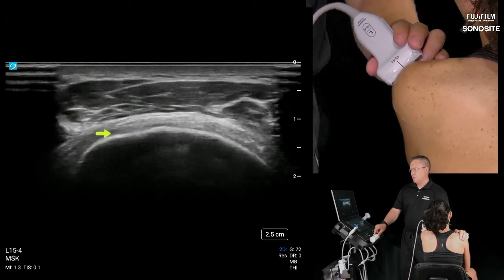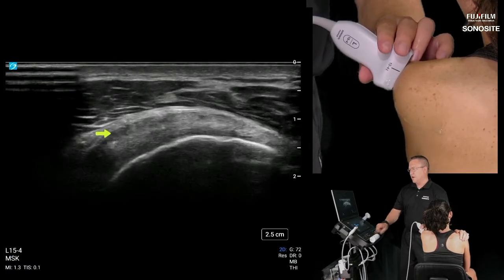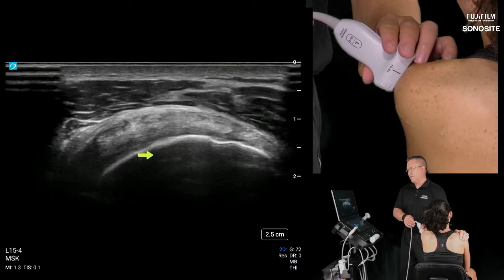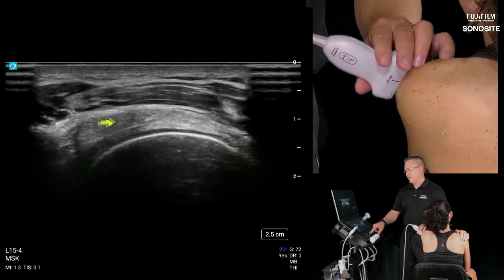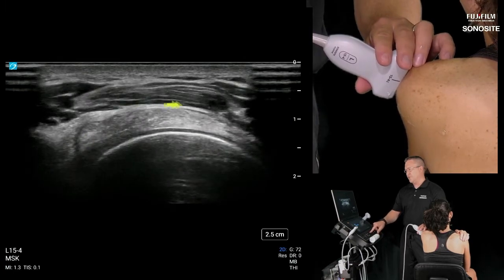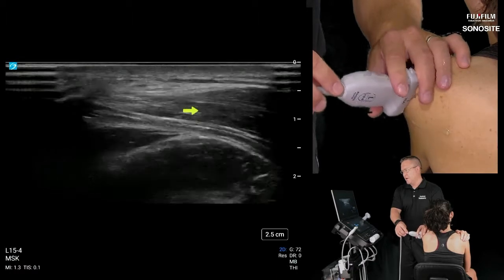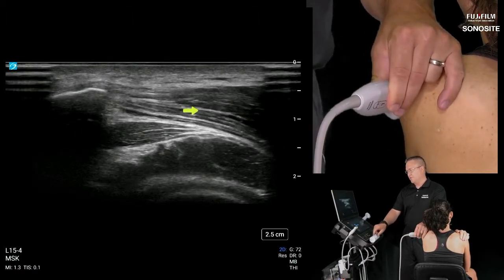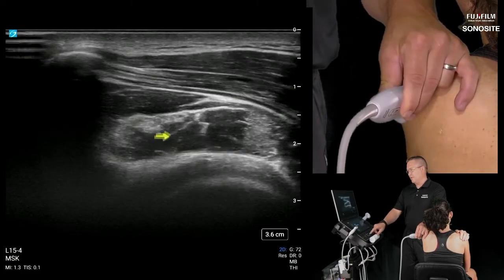Typically, you don't normally see an isolated infraspinatus tear, although I've seen a couple. It's just pretty rare to see just an infraspinatus tear. They're usually involved with supraspinatus as well. So let's follow this transverse infraspinatus posteriorly again and just check our work and go all the way down to its proximal musculotendinous junction. Drop my depth just a few clicks, and then here's that central tendon again.